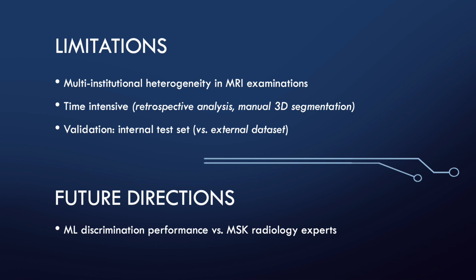A drawback to studying a large population, however, is the substantial effort and time required to manually delineate and contour each tumor, which in the case of the current study required over 1,600 individual manual 3D volumetric tumor segmentations. Auto-segmentation algorithms offer the potential of high throughput processing and are likely to enhance the scalability of radiomic studies.